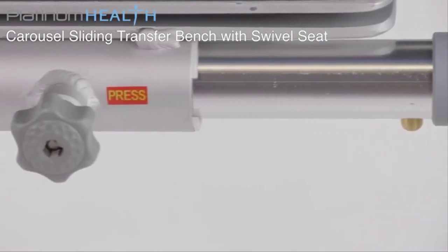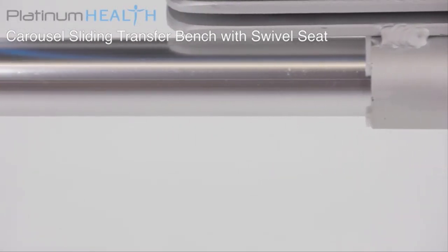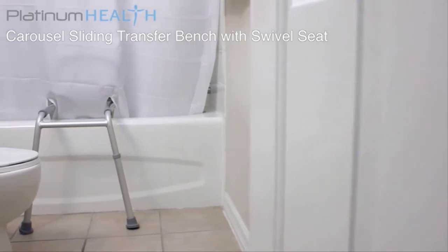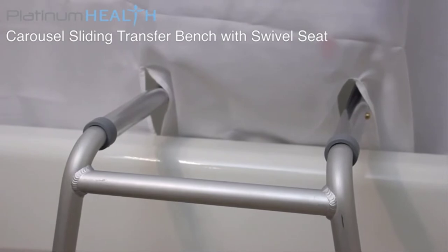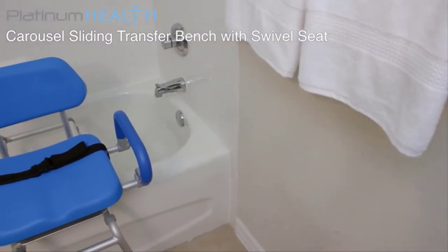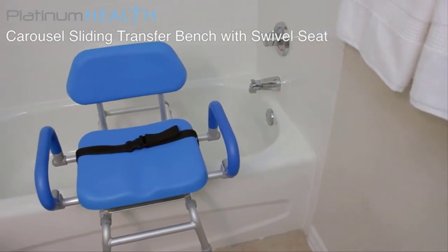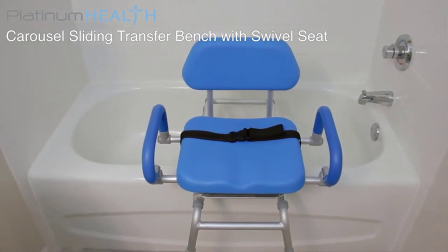In order to integrate with extra high or extra wide tubs, optional vertical and horizontal extension kits are available. For bathtub installations, we recommend incorporating the split shower curtain option to help keep water off the bathroom floor. The Carousel is available in two colors.